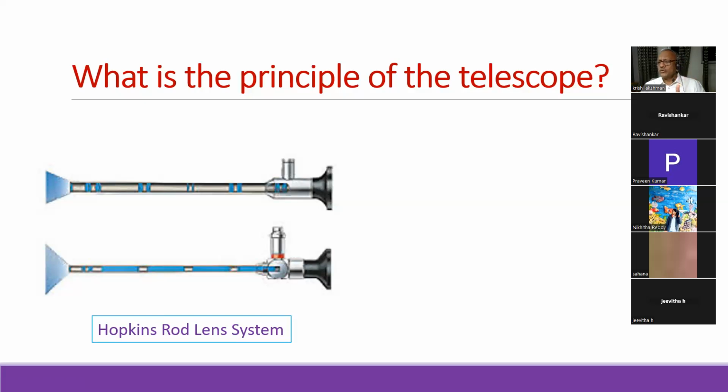You call it the 12 o'clock position. Those are the dials on top of the camera that will be looking at the roof. That's always constant. In a 0 degree telescope, you rotate the lens, the telescope, nothing happens. It's just looking straight on. Whereas if it's 30 degree or 45, if you keep it looking down, it looks down. And if you rotate it 180 degrees, it looks up.